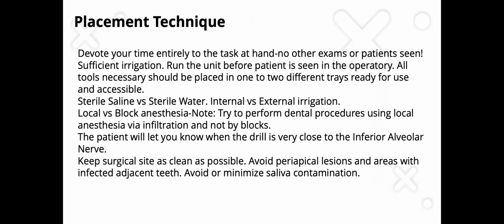As for placement technique, I want to go through anything from start to finish with the procedure on a patient. One of the things I remember is that it was very distracting when I started a dental implant procedure on a patient and one of my team members would come and get me for a dental check. I would prefer devoting my entire time to the task at hand, and I didn't want to see other patients at the same time, because the timing when we're placing a dental implant is critical. We want to use sufficient irrigation.